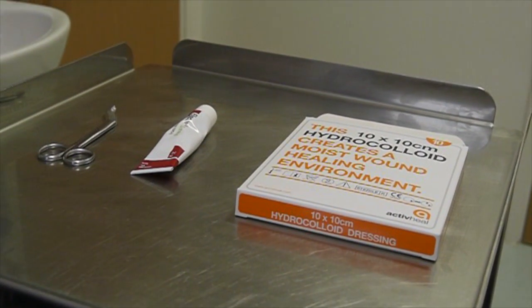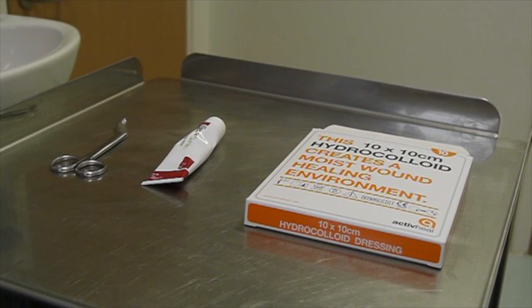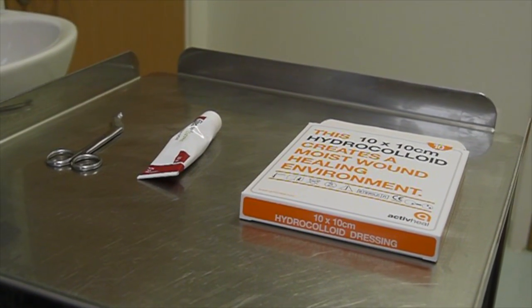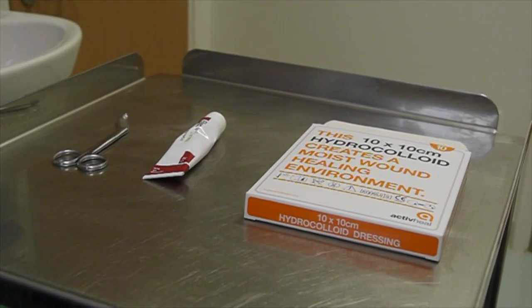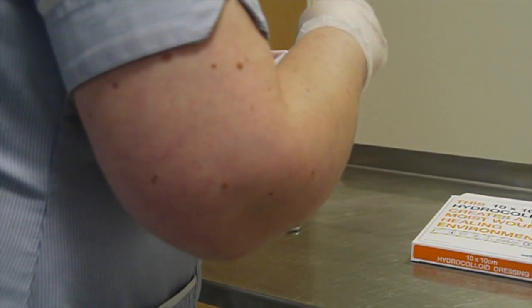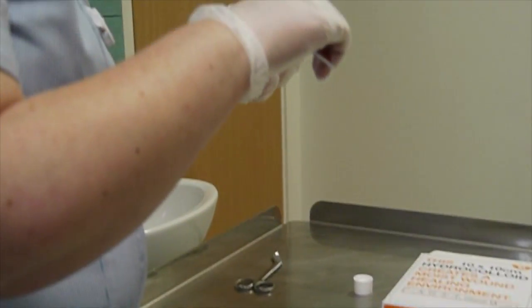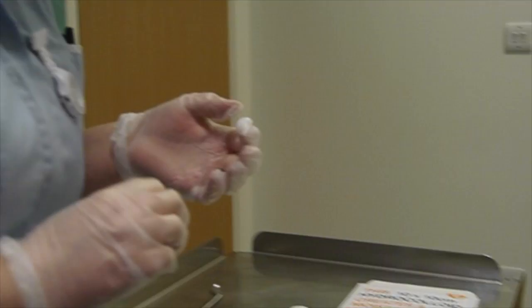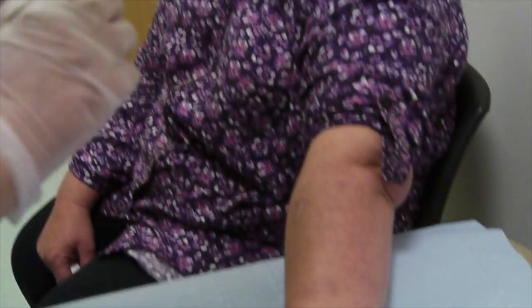Here you can see everything we're going to need to do the procedure. We've got a pair of scissors, a strong steroid ointment called Elecon ointment, and the hydrocolloid dressing. The nurse is wearing gloves to prepare and apply the ointment for health and safety and infection control reasons, but you won't need to do this if you're doing it yourself.